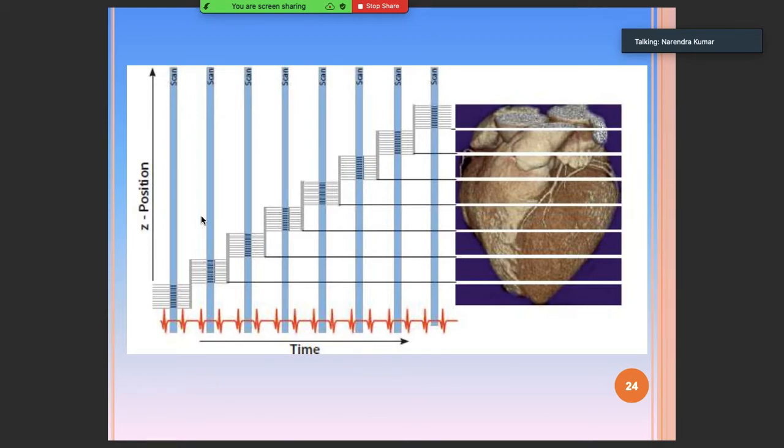So it is important to time them well, because the patient table has to move by the distance covered by the multiple slices between the scans. A technical delay time, what is called a scan to cycle time, has to be taken into consideration.